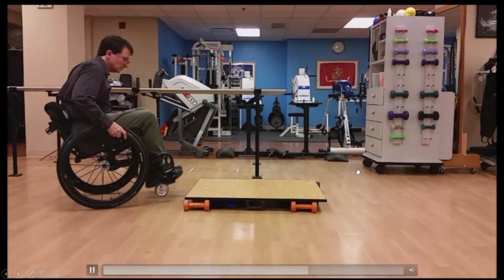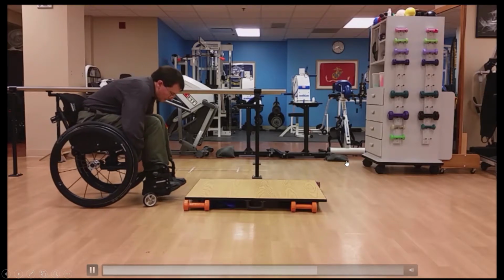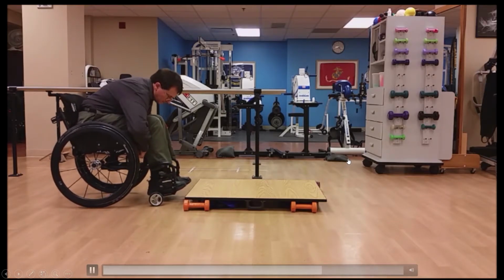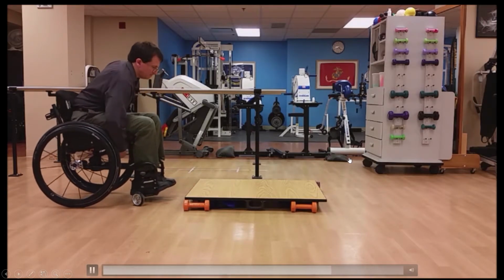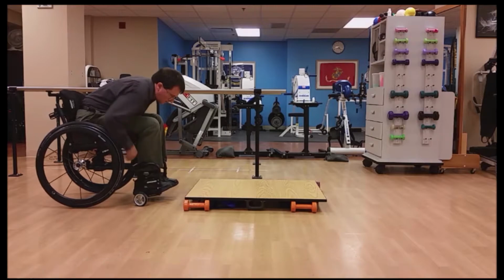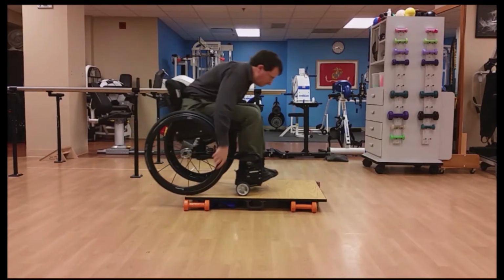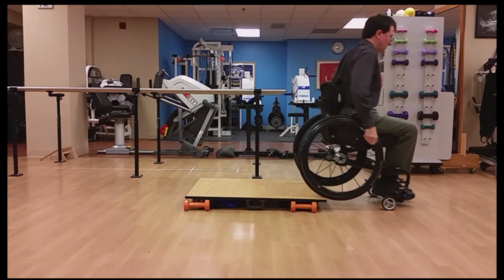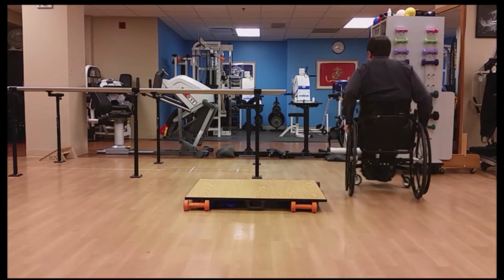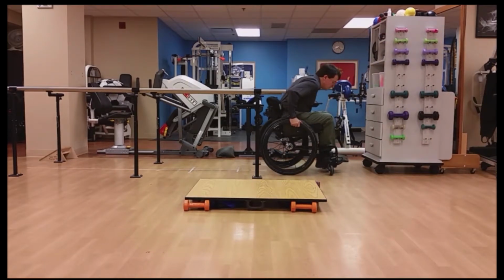Now this is, I believe, 3.5. What this icon also allowed me to do is extend the front frame out a couple inches, so I could increase my wheelbase. If you go with Pythagoras, that would be the hypotenuse between the rise of the platform and the ground, and right over. And obviously I've got a very front heavy chair there, so I almost have to nose down because it'd be very hard to wheelie in that short of space.